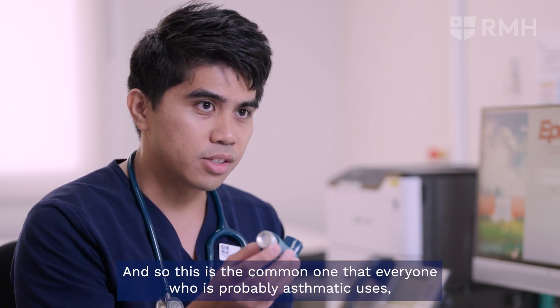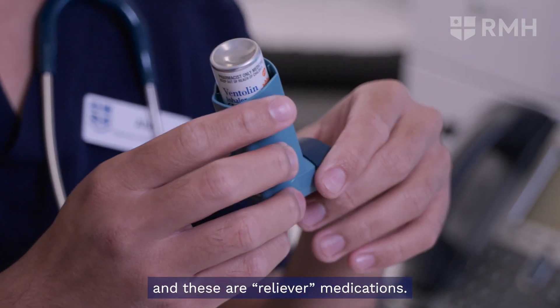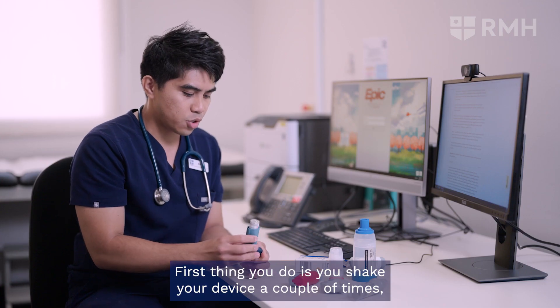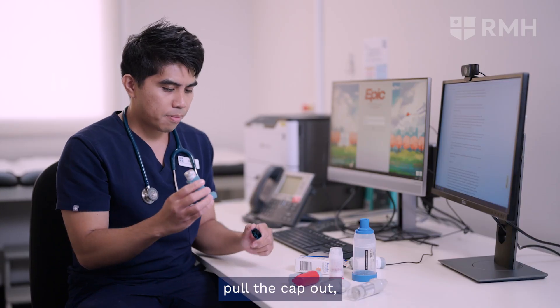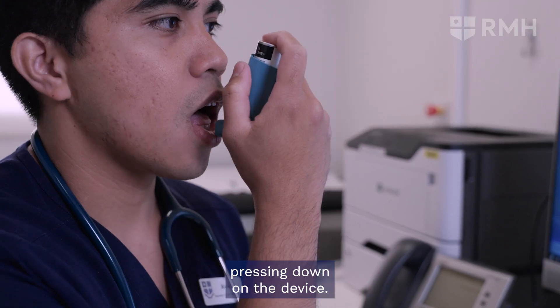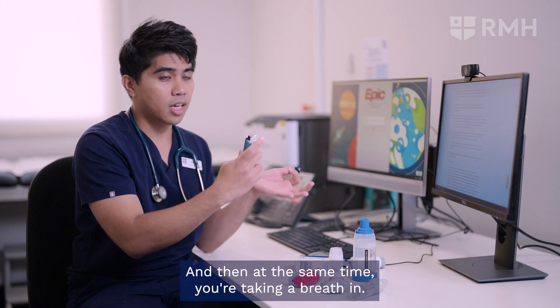This is the common one that everyone who's probably asthmatic uses — these are reliever medications, so they relieve your symptoms of breathlessness. First thing you do is shake your device a couple of times, pull the cap out, breathe out, and then place this on your mouth, pressing down on the device while at the same time taking a breath in.